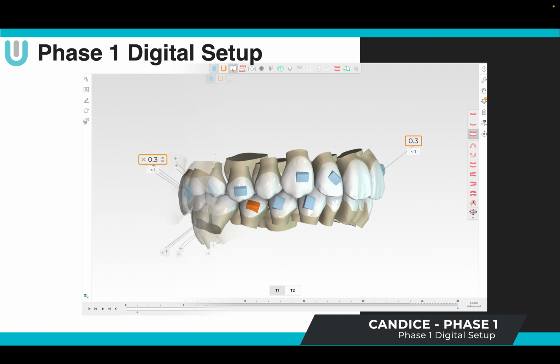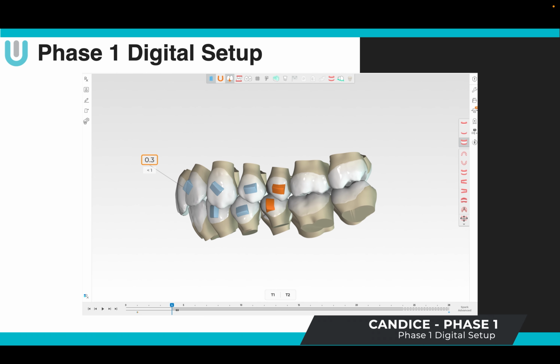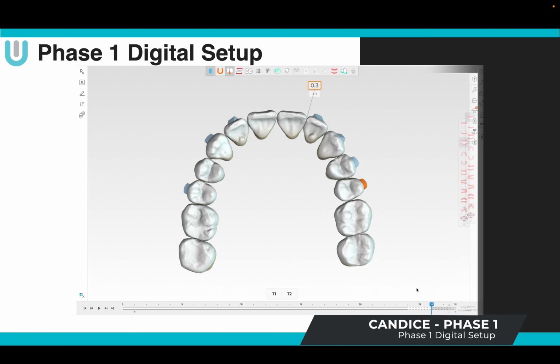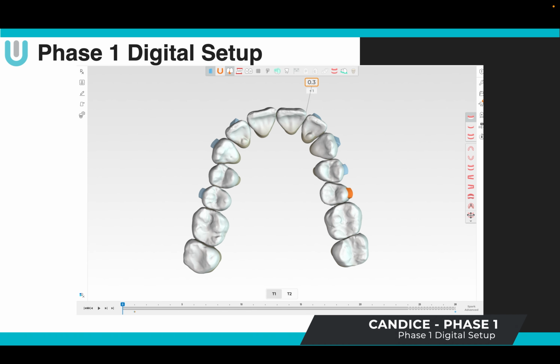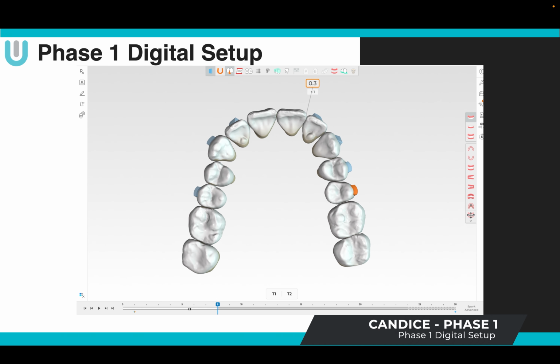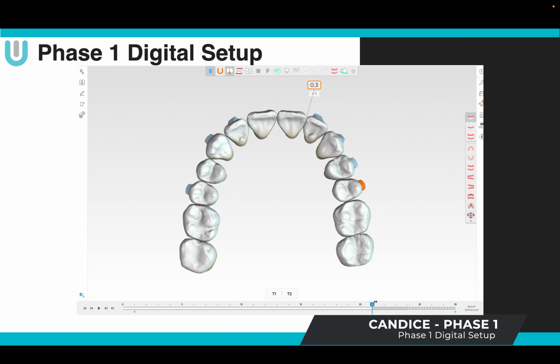Okay. So you can see on the top, we have these kind of 45 degree attachments because I'm trying to rotate and extrude. That would be on that maxillary left canine. Here's where you really see the beauty of the arch development. You can see that we're trying to develop and maintain beautiful arch form. Obviously, tooth number 13 is rotated 180 degrees. We're going to maintain that.